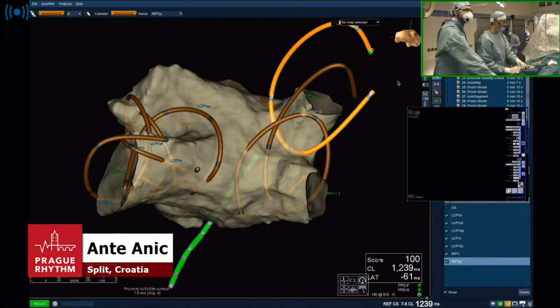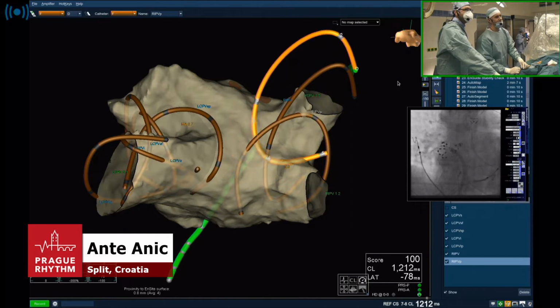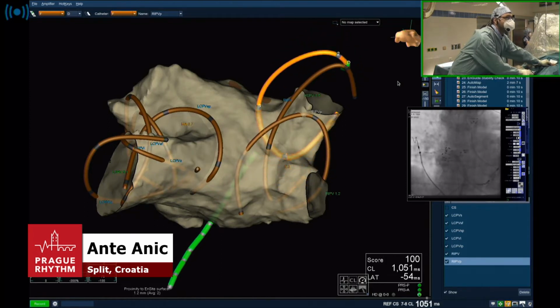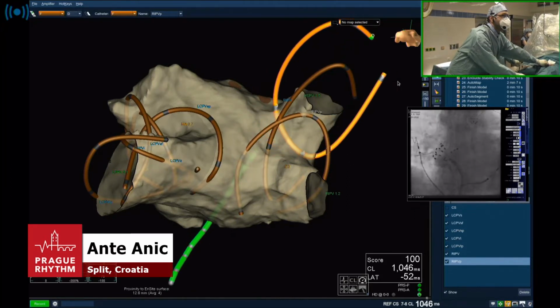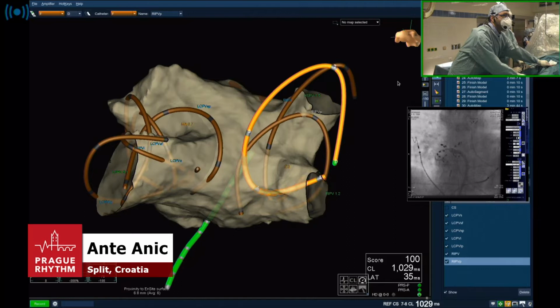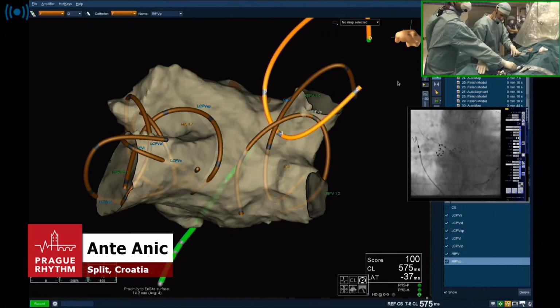So sometimes when there is a big vein, you want to do this. Are we inside? Yeah. We are a bit inside, so we have to rotate. I will intentionally misalign the device, like this. Now inside. Okay. It's a big vein, 20 millimeters, and the device is falling. Okay, I like this. Sorry, in the inferior now. Just let me go up here. Yeah, that's much better. Keep the wire, please, Predrag.